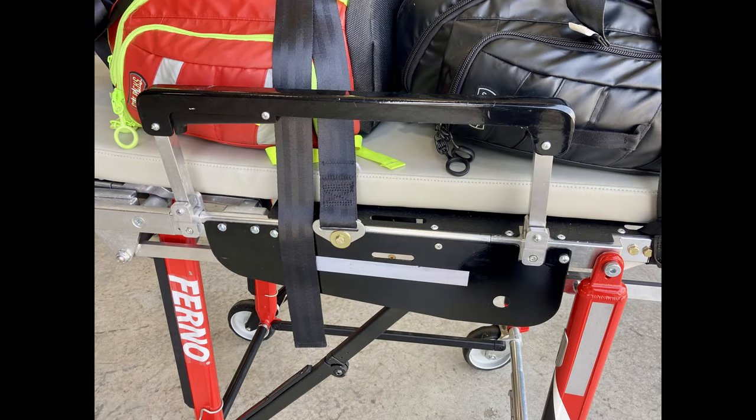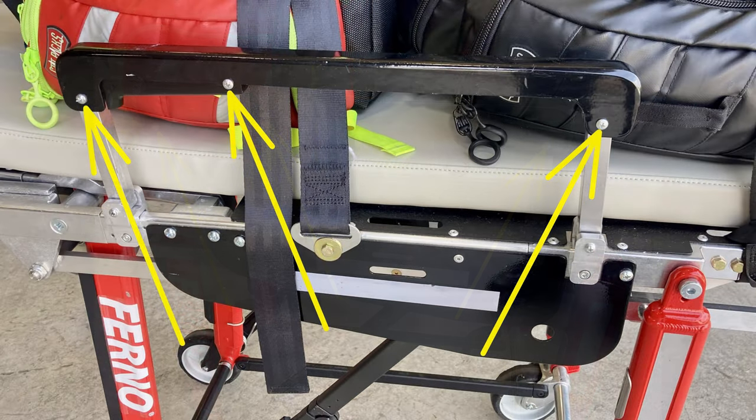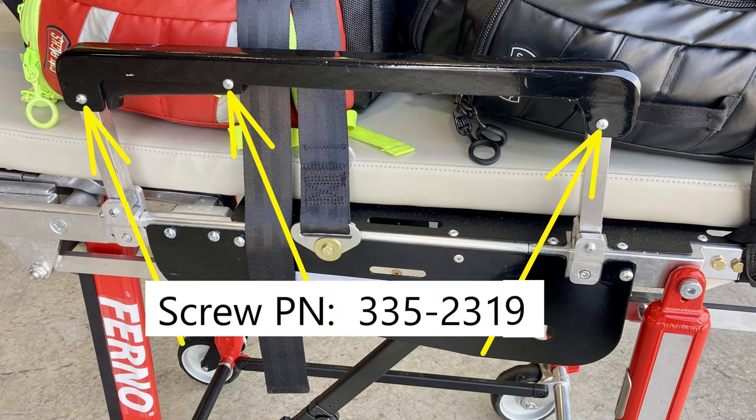If you're the mechanic for this stretcher, keep an eye on the armrests. The way they operate: there's a lock you grab to unlock, and it slides up and down. There are three screws on the outside and three on the inside with a threaded insert holding both sides together. Those screws are going to get loose and fall out. The part number for those screws is 335-2319 and they're held on with blue Loctite 242. If one is loose or missing, put some Loctite on it and snug it back up.